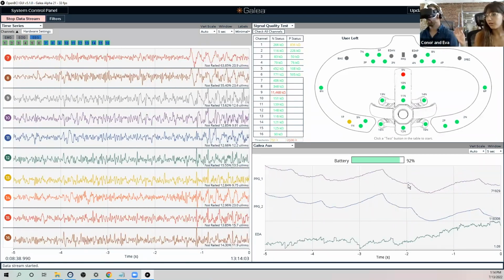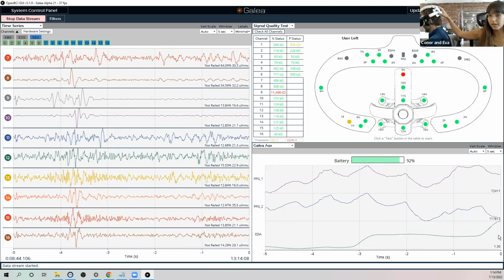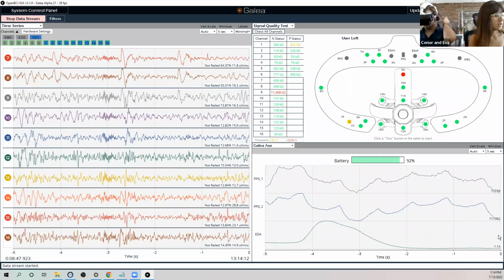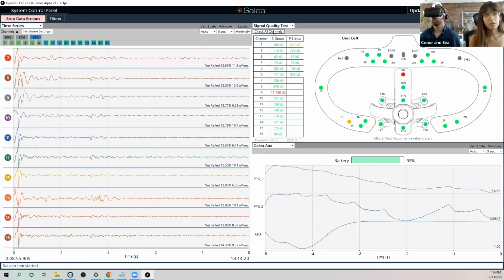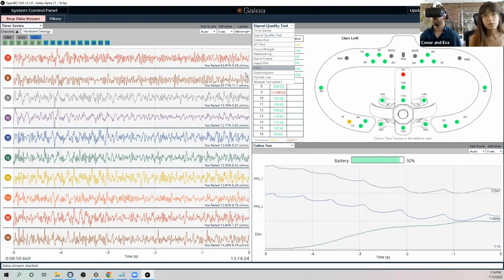So maybe you can turn your head around a little bit so they can see. So the active electrodes are located here and then along the midline. Great. So I think first we can start showing them the EMG data. So if you can just leave the EMG channels and open the EMG widget.